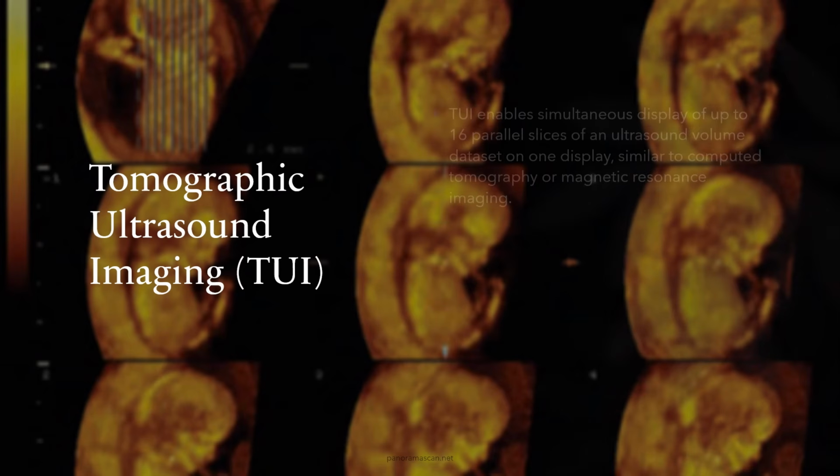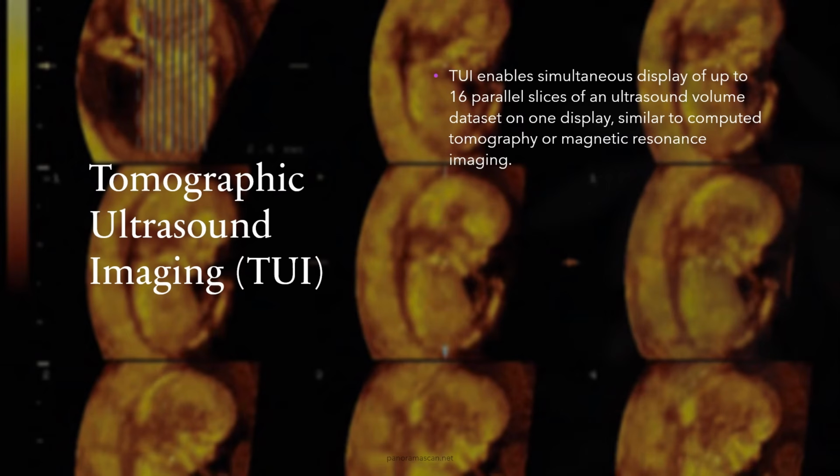TUI enables the simultaneous display of up to 16 slices from an ultrasound volume on a single screen. This provides a clearer and more detailed view of anatomical structures, enhancing diagnostic capabilities. Whether using static 3D datasets from previous scans or real-time 4D data for dynamic imaging, TUI accommodates both, allowing for versatile imaging during assessments.